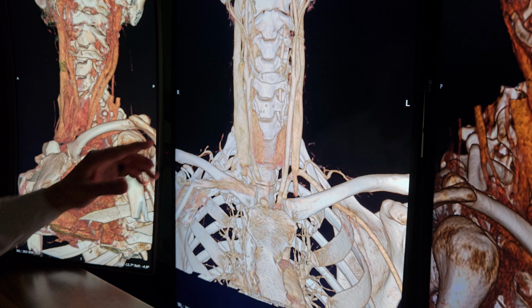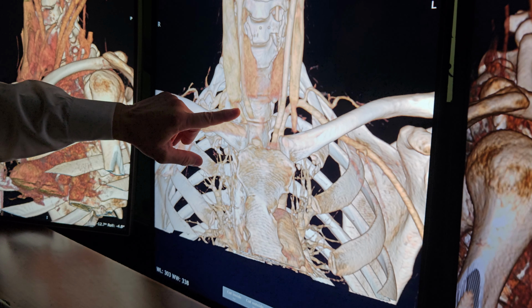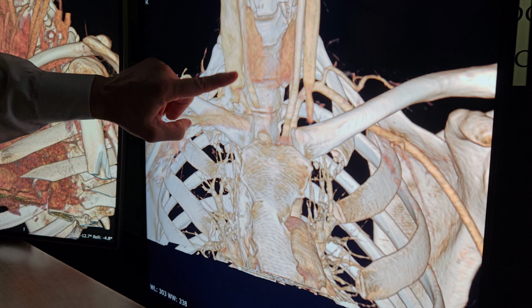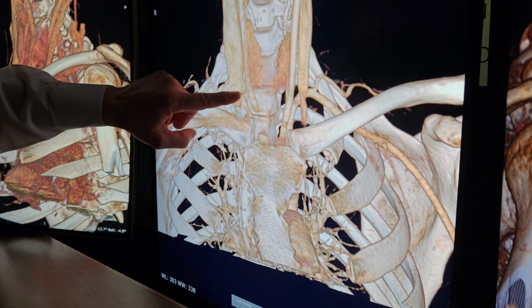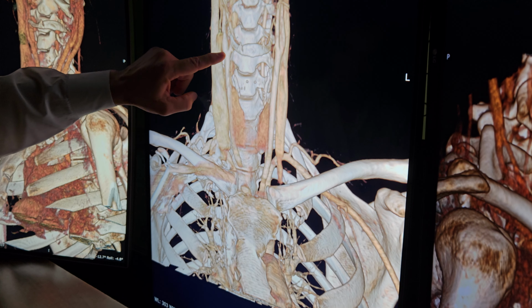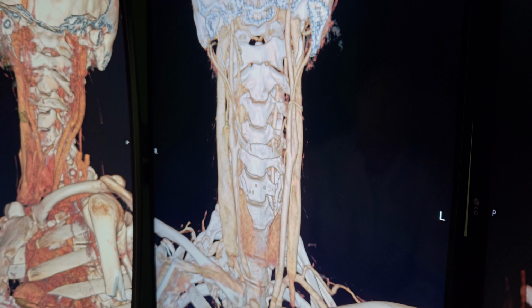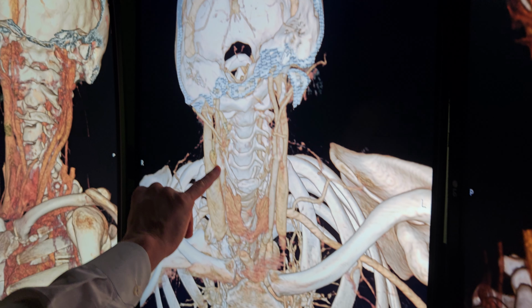We did ultrasound. So we're seeing the jugular vein on the right. We found a compression or something down in here. When we compressed the jugular vein with the ultrasound to see if it was compressible, it was compressible. There's some restriction in there. That seemed to trigger a little bit, but when we came up with the ultrasound through here and then went into here, this seems like what's causing the dysautonomia. This is what's going to cause you to pass out.